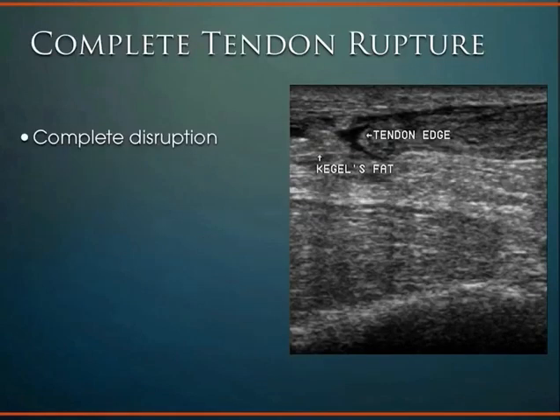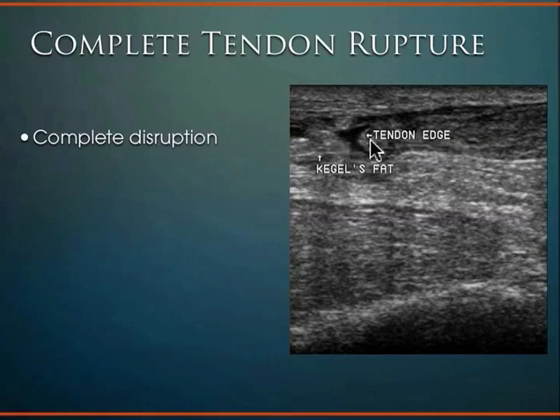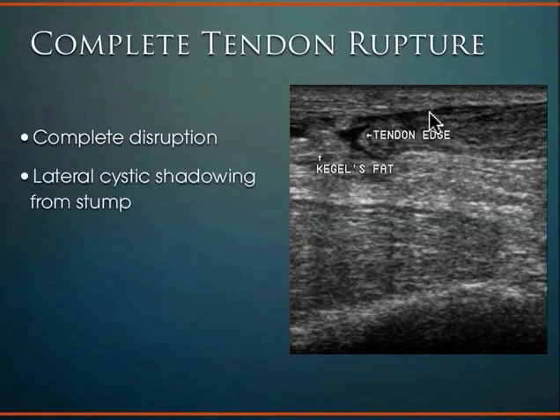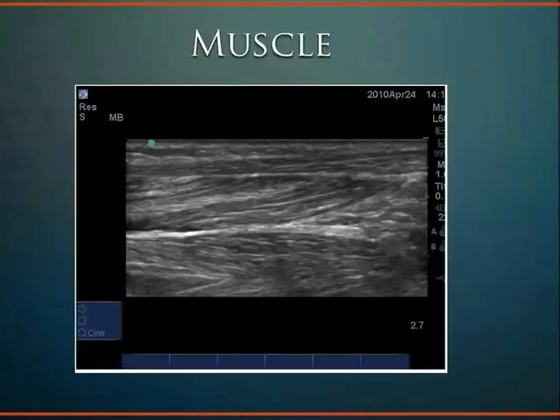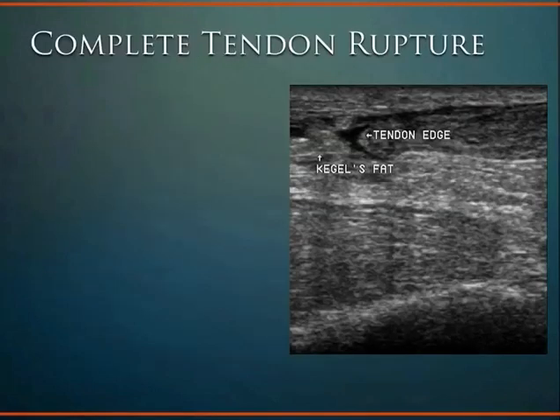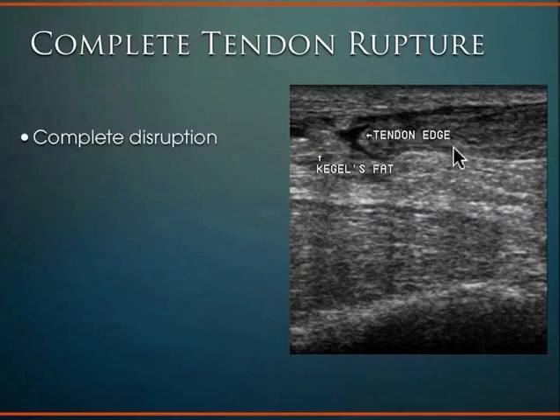For a complete tear, you can see the leading edge of the tendon with obvious disruption, retraction of the tendon, and a localized fluid collection. Taking that through range of motion, you would basically see the tendon stub retract — you can see that dynamically, which is quite helpful.